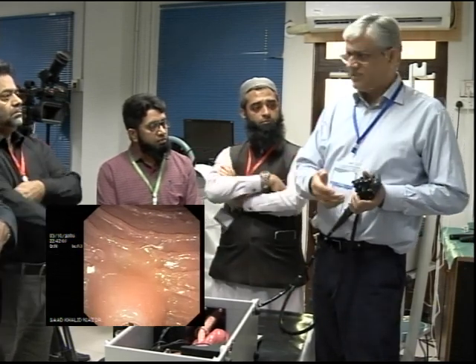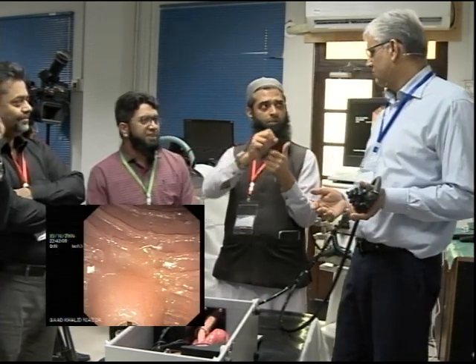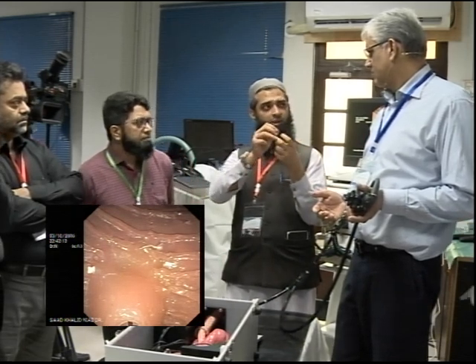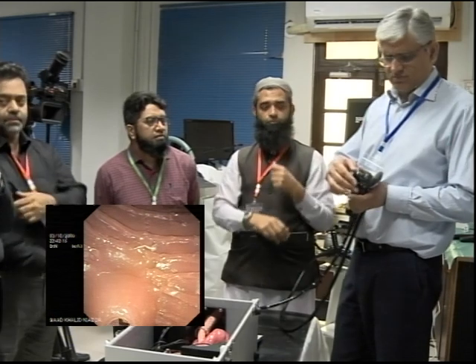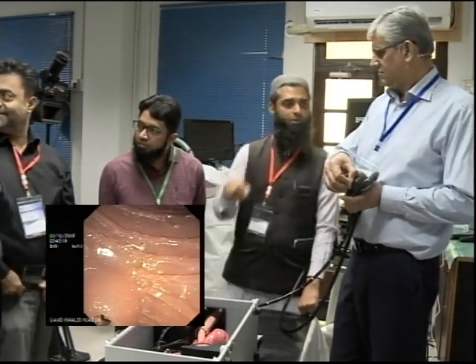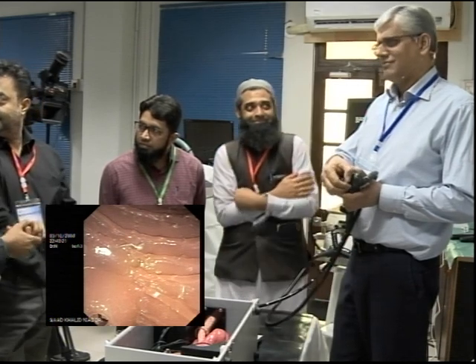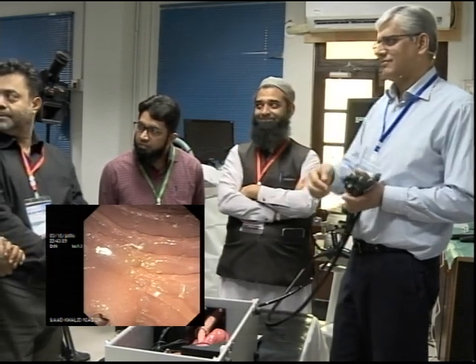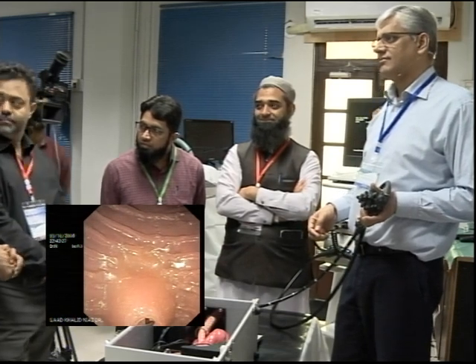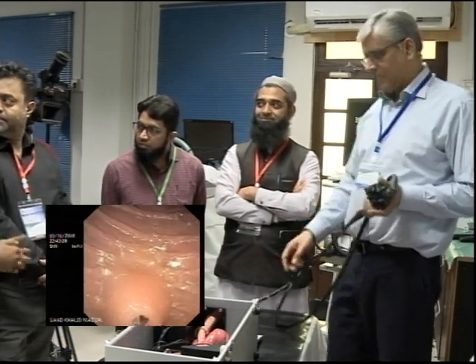Okay. Partially, how do you partially lock? It's a lock or not, or it's in between. The important part here is that after it fits, you look at the ball, not the back. If your eyes are glued on the screen, it's unlikely that you lose the position. The problem is that when you bend it, the assistant says, you lose your position.